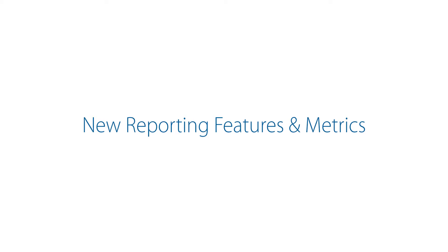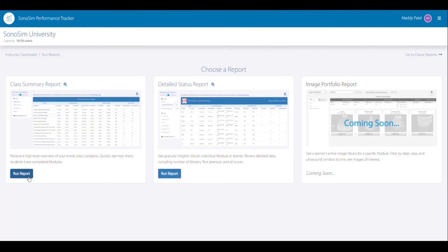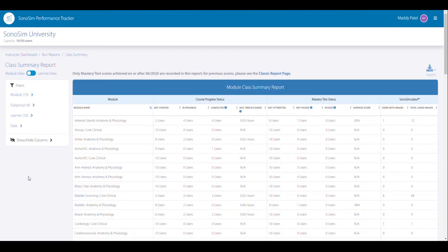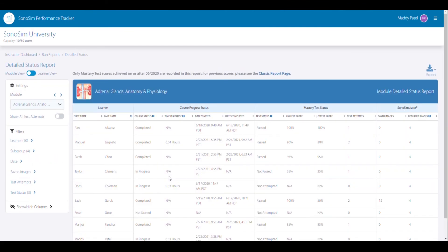The new Reporting Landing Page in Performance Tracker allows you to choose the report that is right for you. Without the need to download, the new Class Summary report gives a high-level overview of how your class is doing. The Detailed report gives new granular insights into learner data, including showing the number of mastery test attempts and scores.